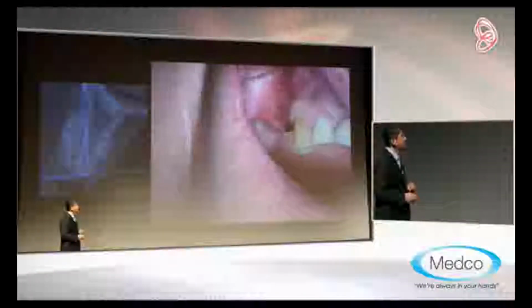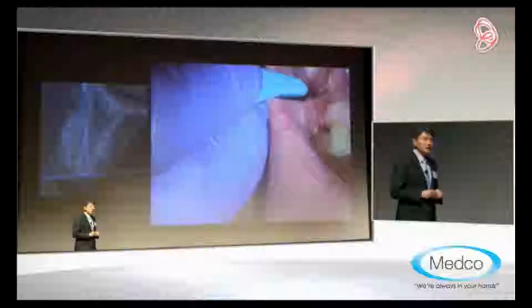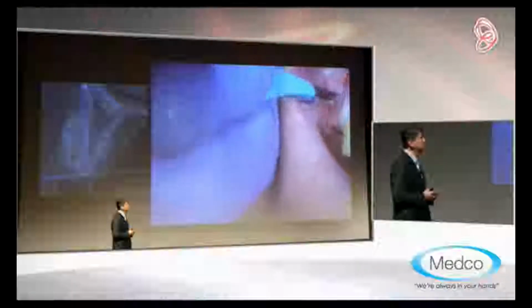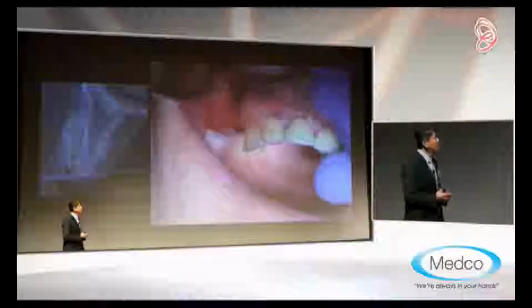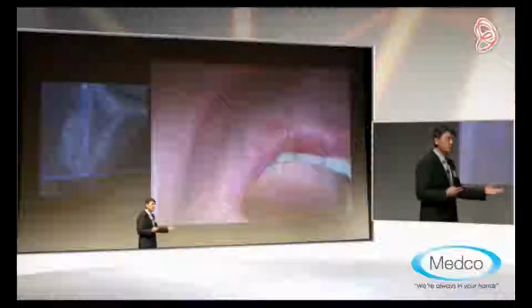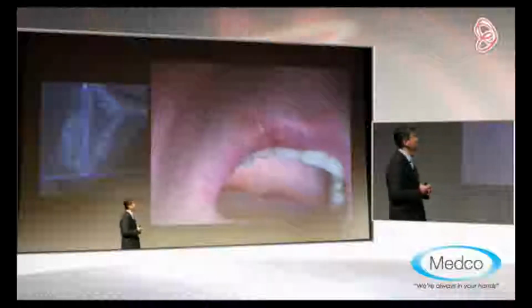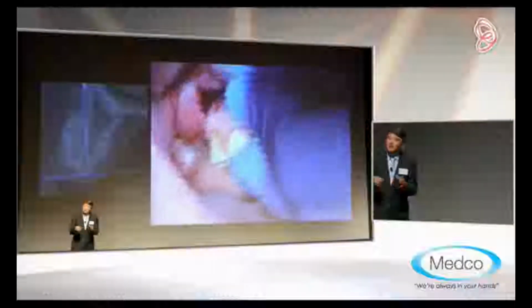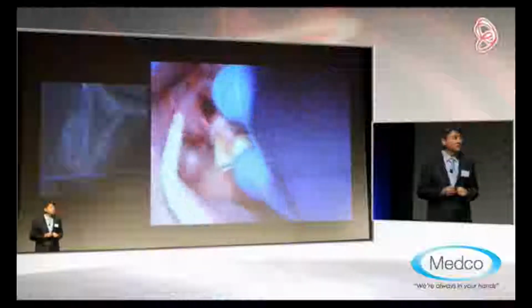With MIT technique, we make a very small incision. We try to avoid crestal incision, and we just make one long vertical incision beyond mucogingival junction, because mucosa will expand. And believe it or not, even though we're working through a small tunnel, we're able to see everything. And we will use the back action chisel to remove any residual periosteum. And we will introduce collagen membrane, which will act as a tunnel for us to introduce bone graft material. So here, we are just decorticating and relaxing the flap internally.